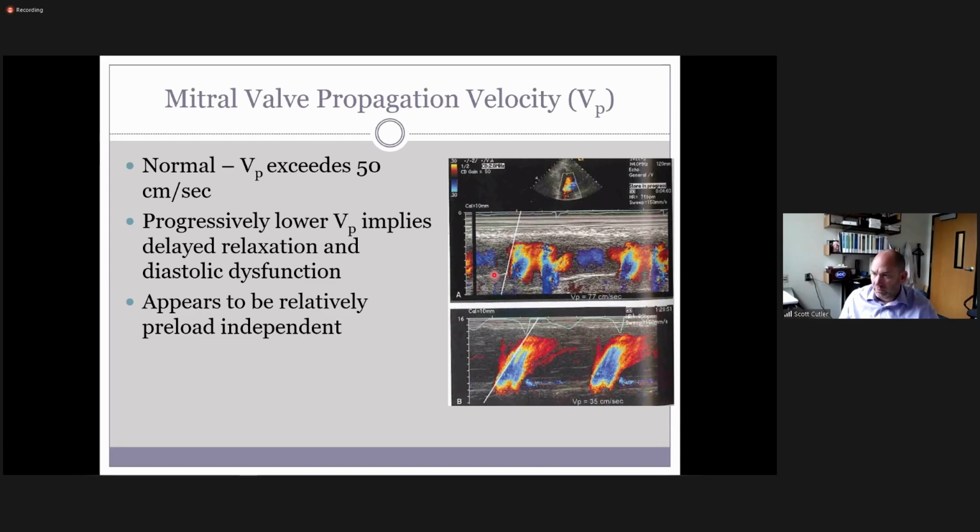That's the mitral valve. When it's closed, you see the line; when it's open, you don't see the line. That's when the flow comes in, and we're looking at how long it takes to get from here out towards the apex, okay? And we're just measuring the slope. Now this line that they've got there should actually be placed right on the aliasing velocity. So I'd put it on the border of the blue and red. They've got it slightly to the left. It's not quite where I'd measure it. The other one shows less of a slope, which is going to show poorer function.